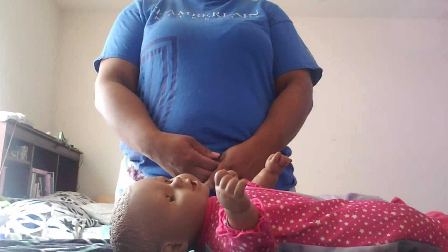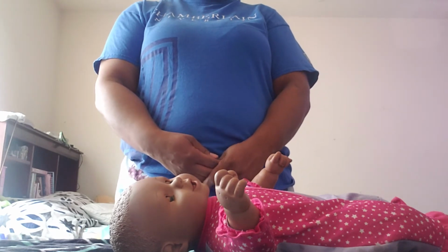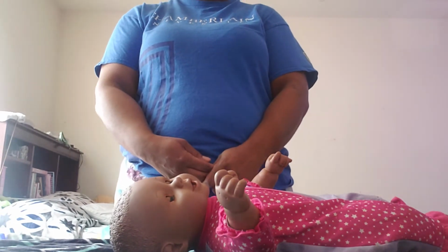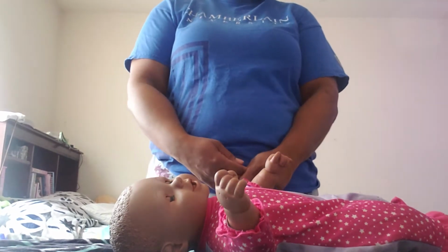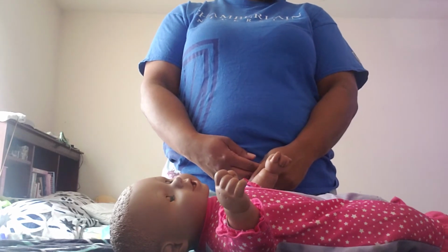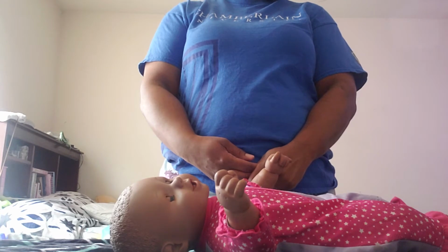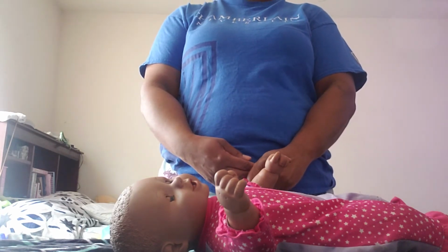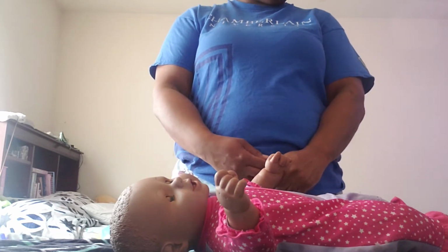This video is for Nursing 224, the insertion and removal of an NG tube. Prior to going into my patient's room, I will assess the chart for any nosebleeds, any signs of aspirations, any nasal polyps, any anticoagulant therapies, any chronic sinus infections, or any sinus or nasal surgeries. So I reviewed the chart.